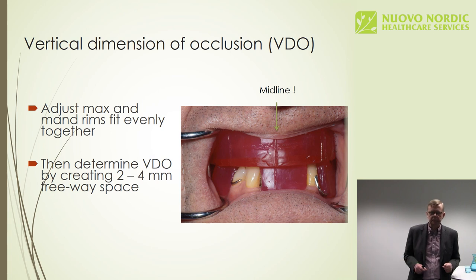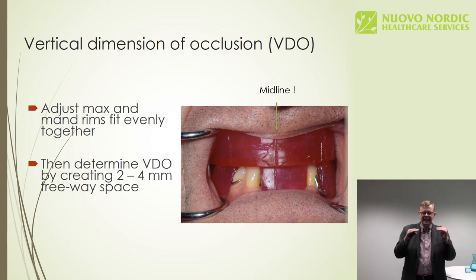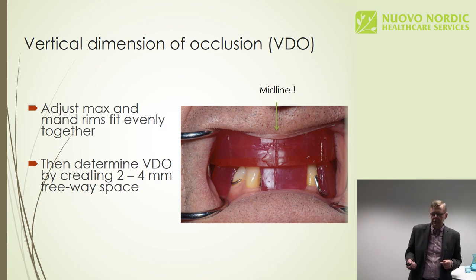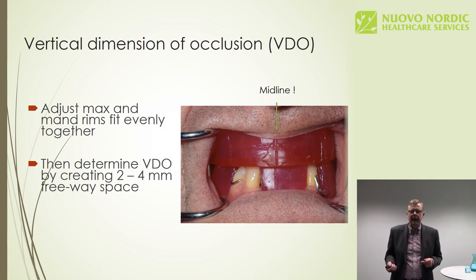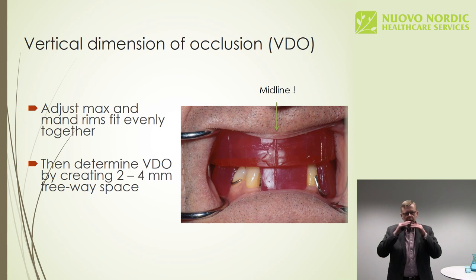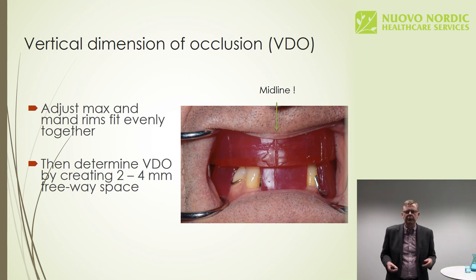It's ready. Once we're done with that, we'll adjust the lower jaw, the mandibular wax rim, to bite evenly together with the maxillary jaw relation record, and define the vertical dimension of occlusion. This is quite important as well, because if the vertical dimension of occlusion is too high, it will be difficult for the patient to swallow, to talk. It's like having a big potato in the mouth.